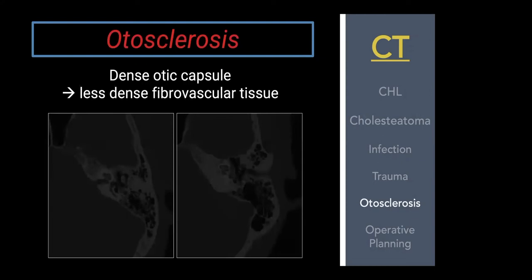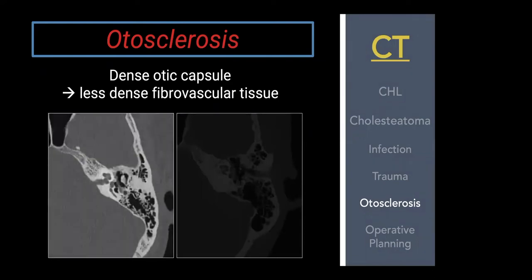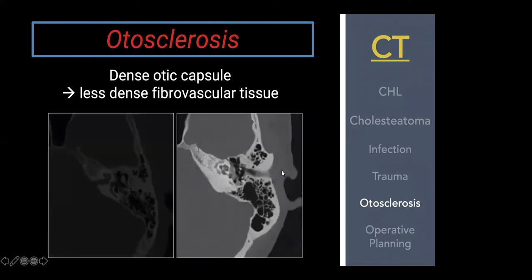Otosclerosis is a process where the very dense otic capsule — one of the densest bones in the body — has areas replaced by less dense fibrovascular tissue. Since we're measuring density, CT is excellent for this. On the left is fenestral otosclerosis: a very subtle hazy decreased density just anterior to the oval window. On the right is retrofenestral or cochlear otosclerosis, where you can see the dense otic capsule has been replaced by less dense bone all the way around the cochlea.